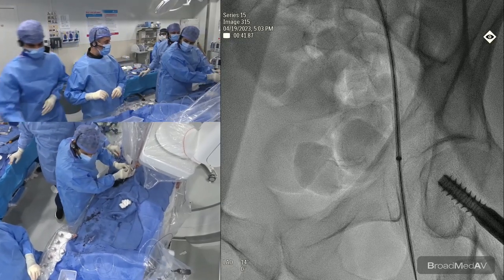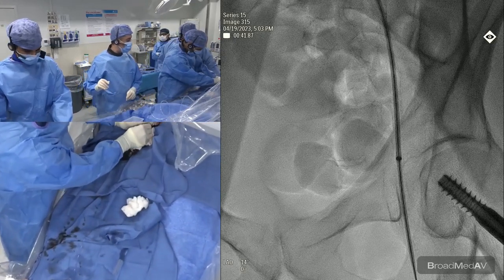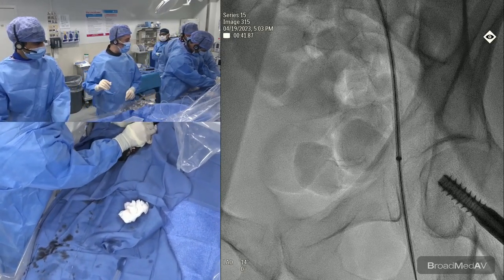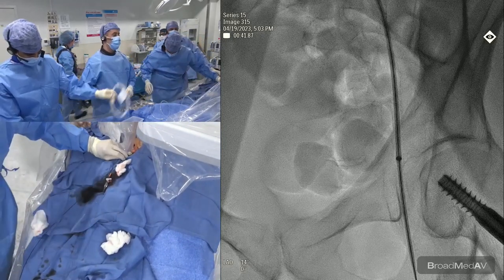035 Navi cross. Uh-huh. And in there. I can get this in. Can we get dry gauze, please? You can probably push it in, huh? Yeah, just trying to get a dry gauze. It's a Cook sheath, so that's why. A Cook sheath. Yeah, the diaphragm. A little harder. There you go.